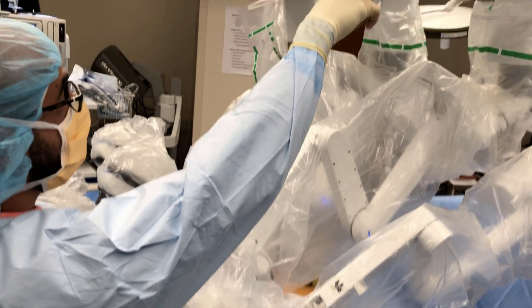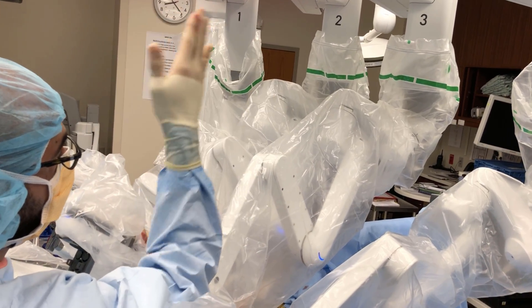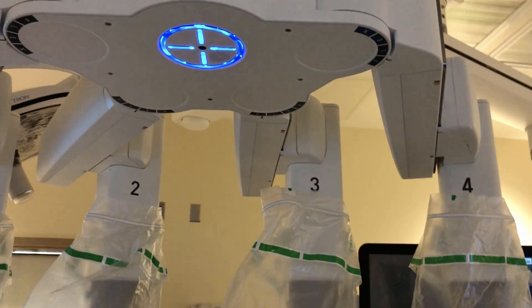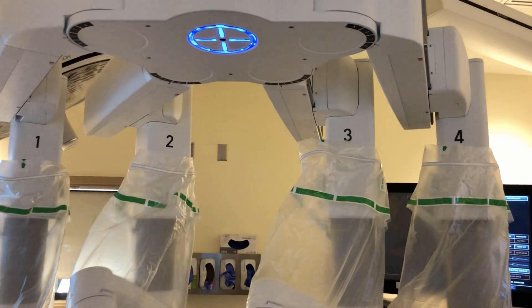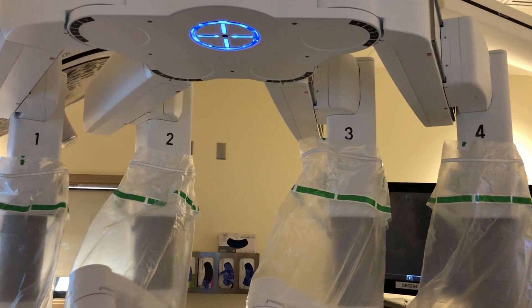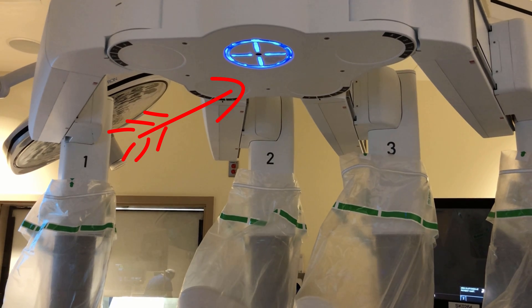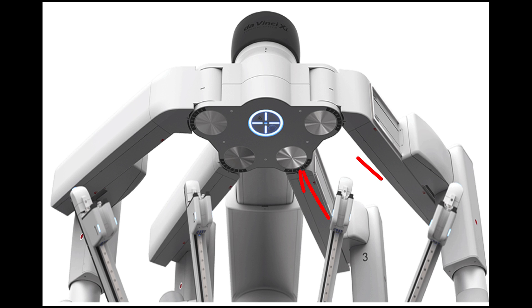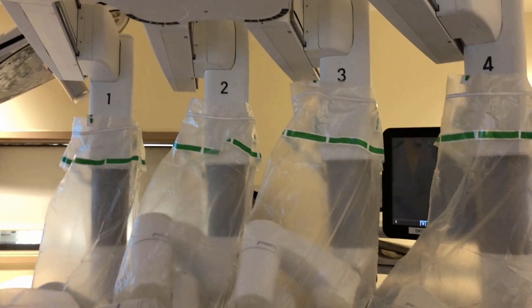Once this is done, dock all the arms to the robot. Then line the trajectory of the camera port with the center part of your dissection, as I'm pointing here, and arrange all the other flex joints — the topmost joint — parallel to the camera port arm. I have a top-down approach to docking the robot: the very first thing I look at is the laser, pointed to the camera port. Once the robot is docked, the next thing I visually address are the flex joints.